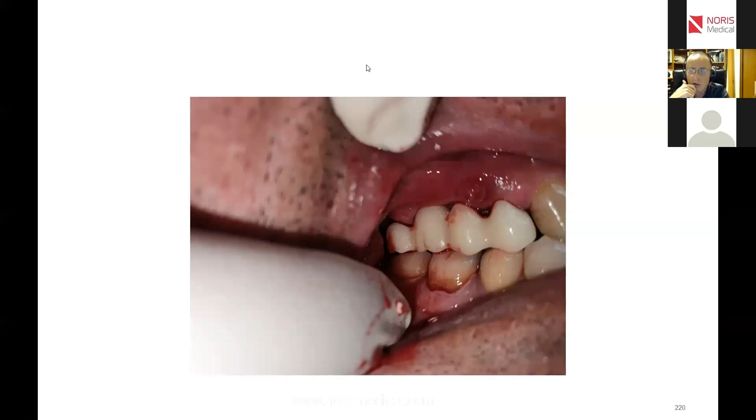Today, I do all the cases, grinded, not grinded, at the day of surgery. All the implants, all the cases are done digitally. As I was asked also by Tom, are the mono implants FDA approved for USA and Canada? As far as I know, yes, they are FDA approved. But please, I will refer someone that really deals with that in order to answer the question after I give the microphone back to Noris.